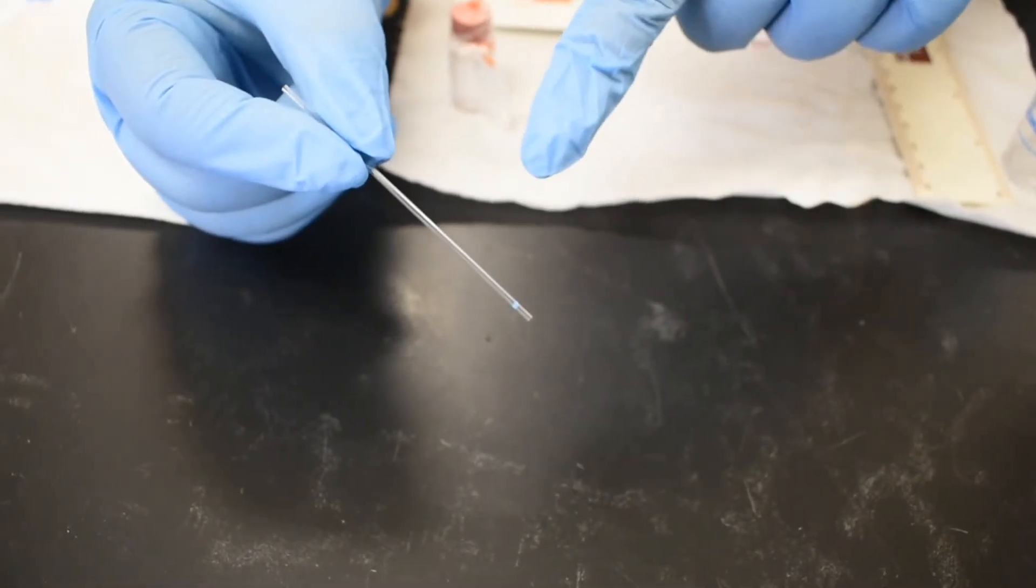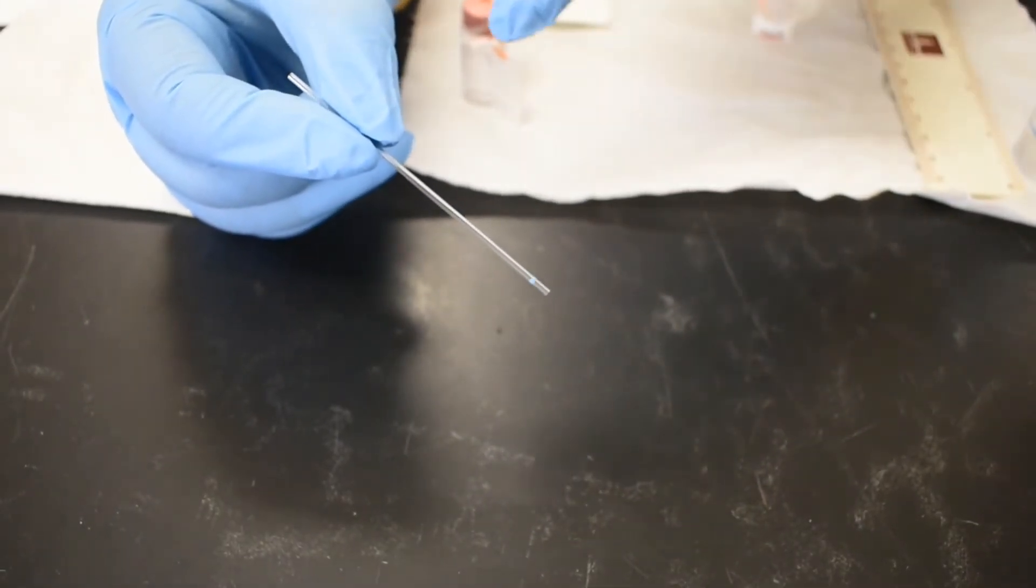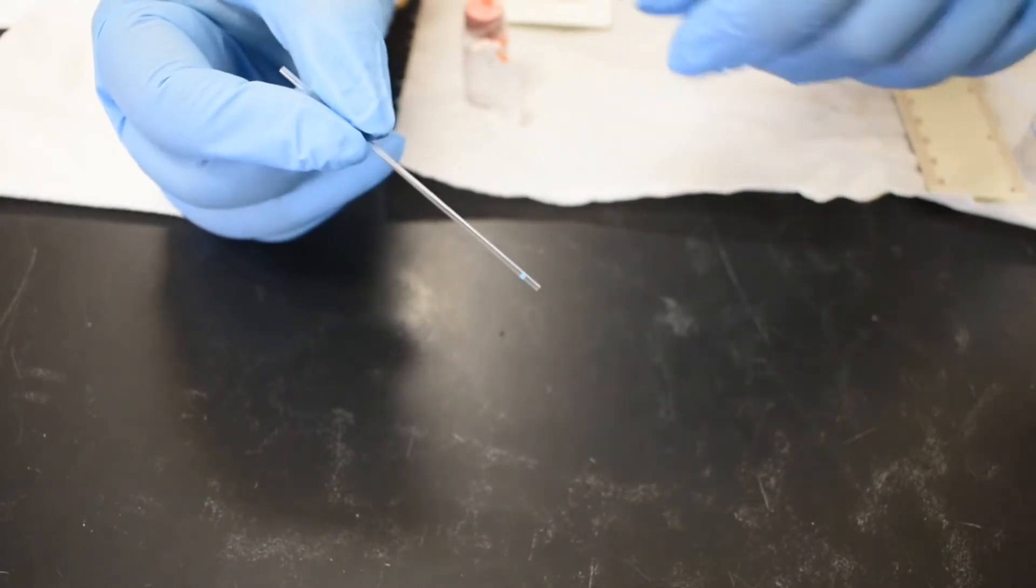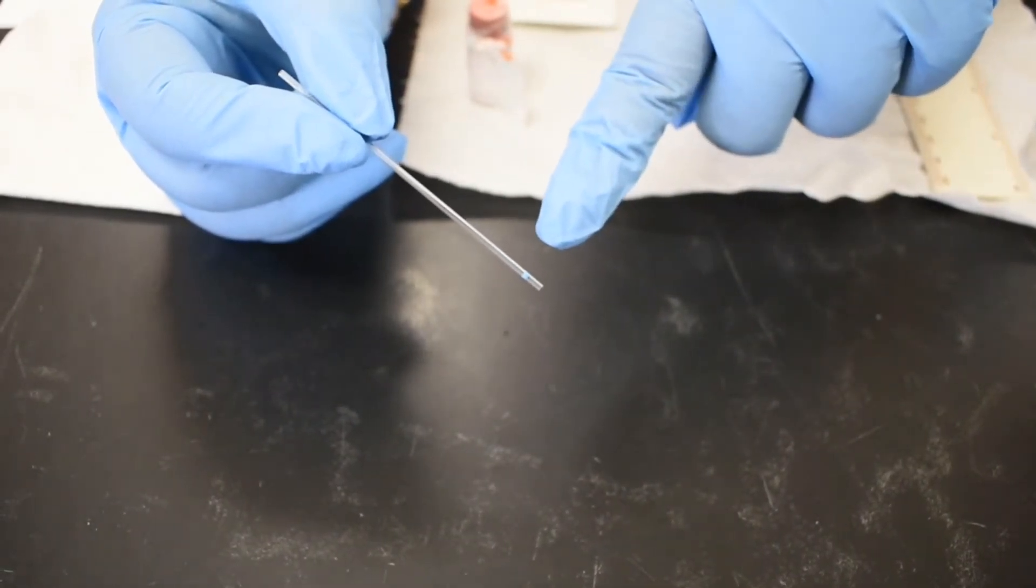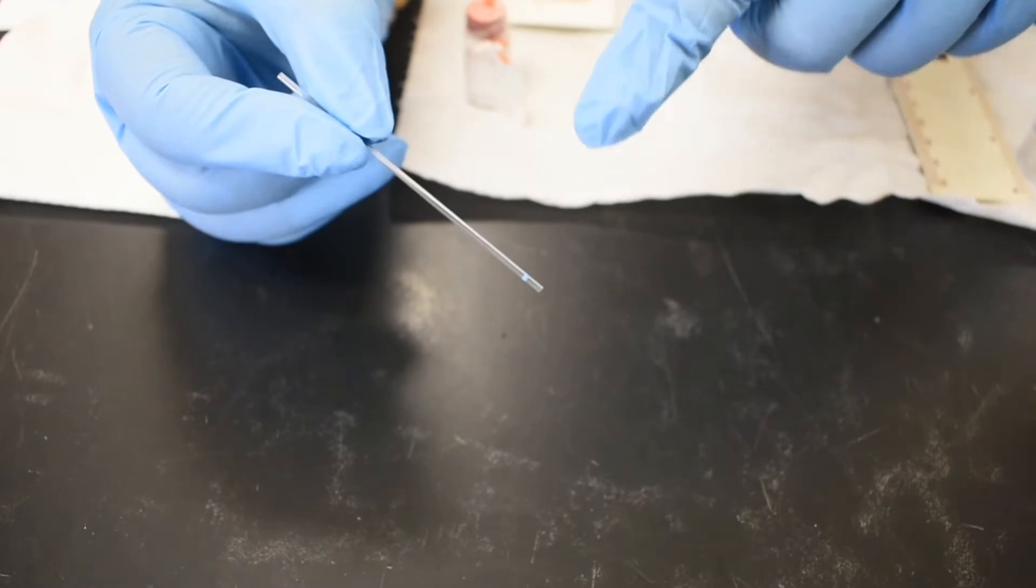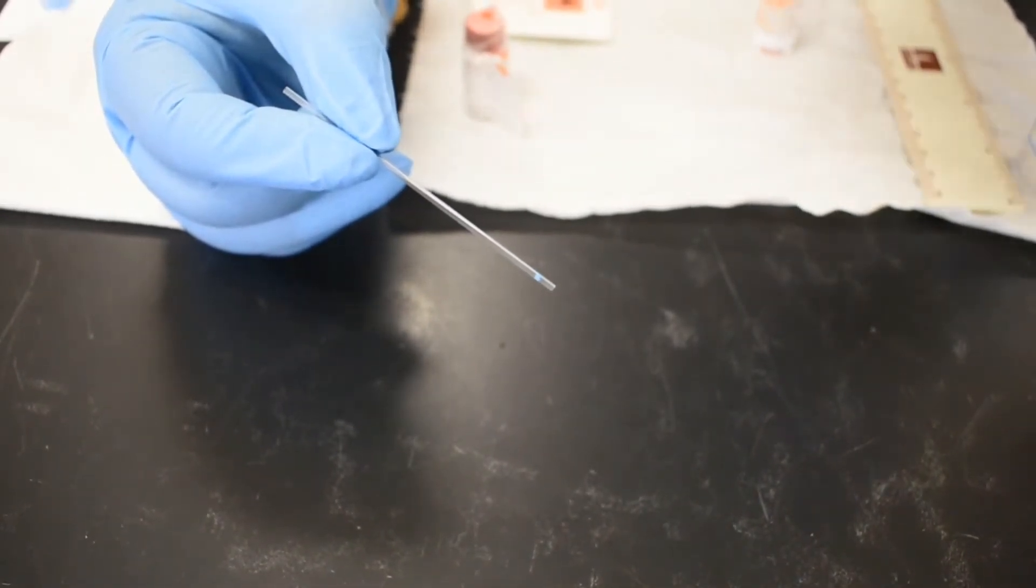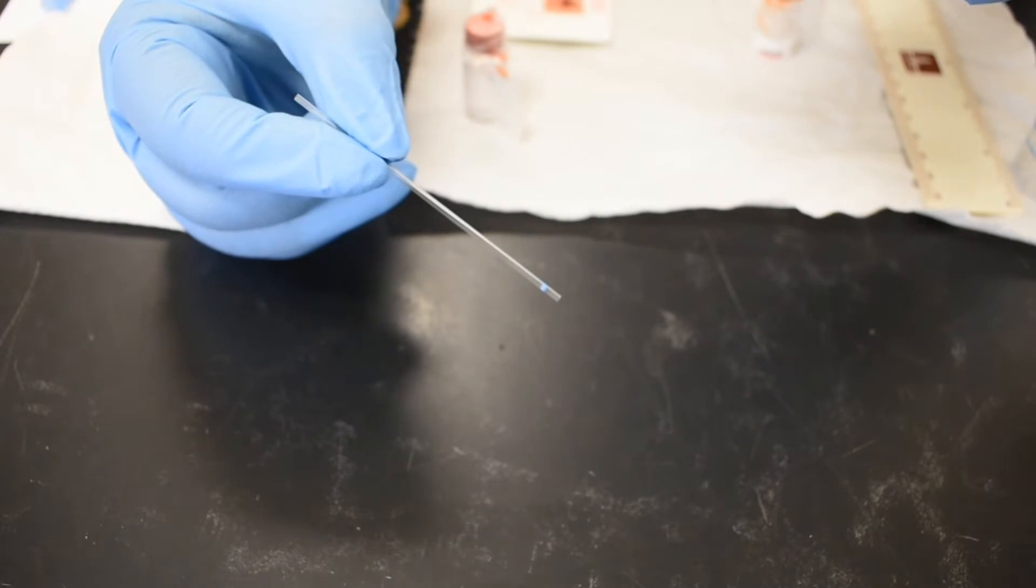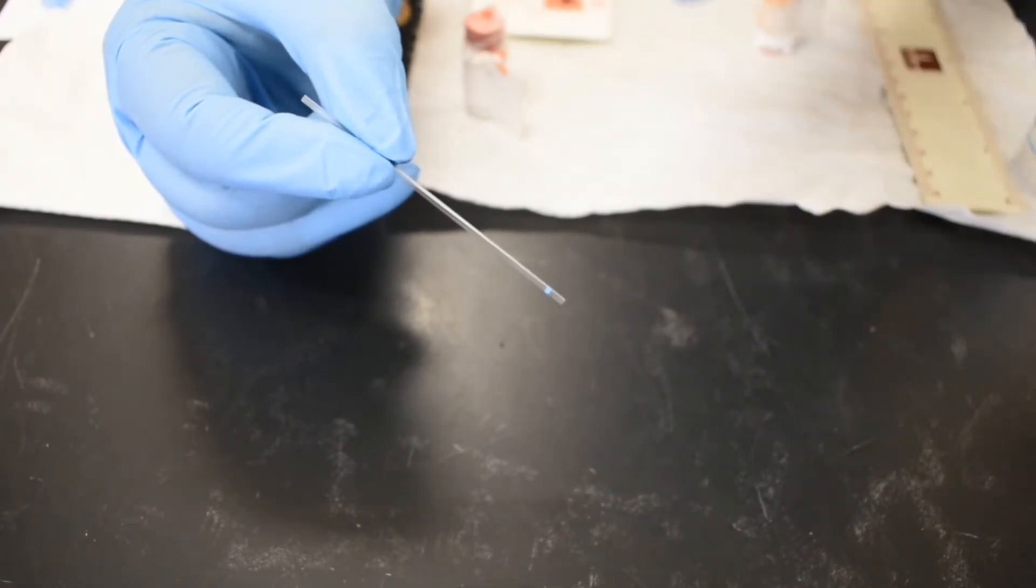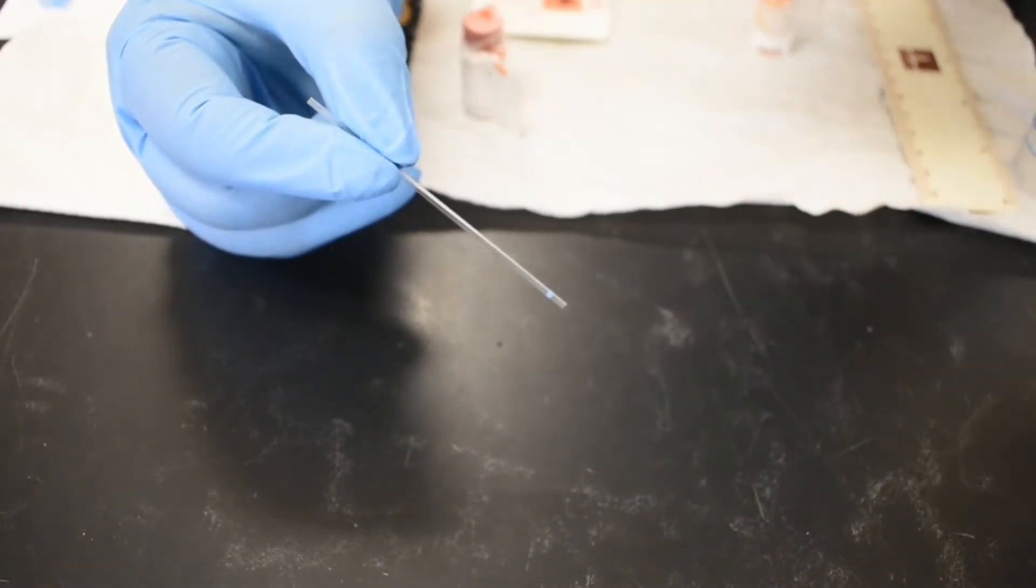Here is the micro capillary tube. We will draw blood into it. If you look carefully, on one end of the capillary tube there is a blue ring. Make sure you dip that end into the sample to draw the blood, and I will explain to you later why I am suggesting to do that.